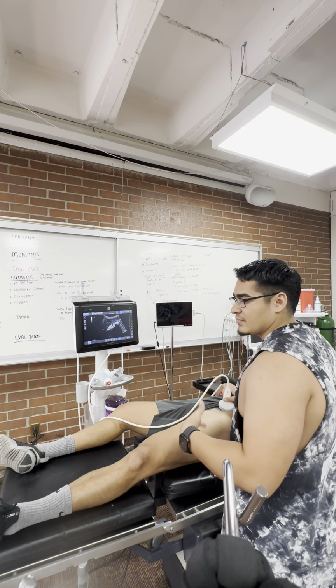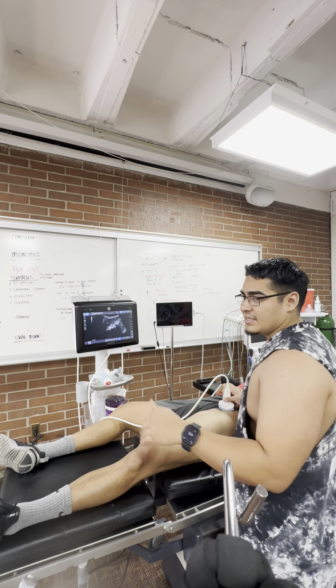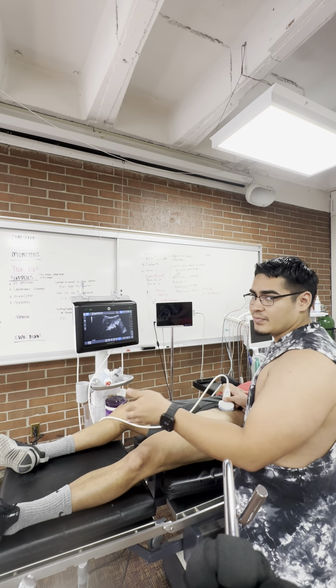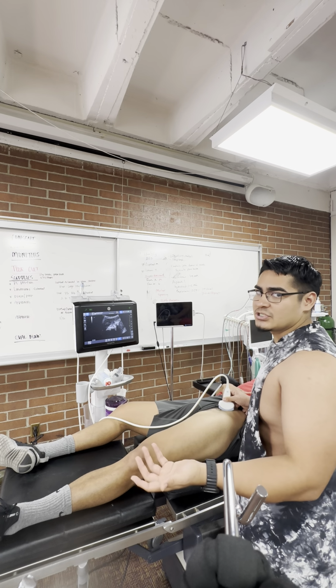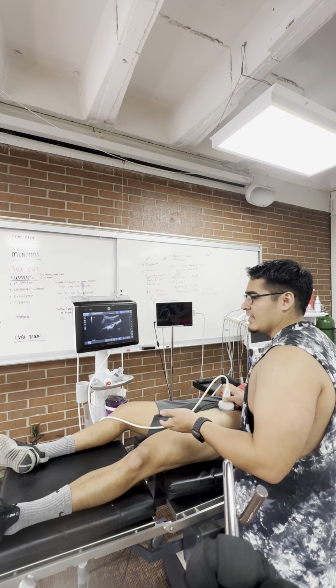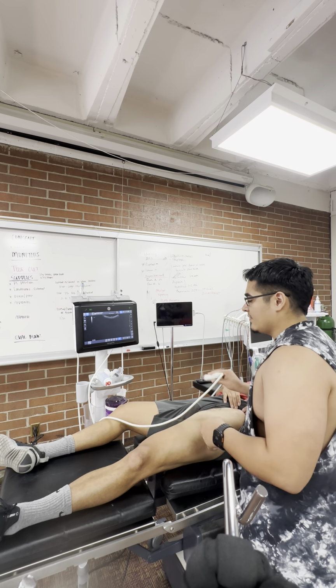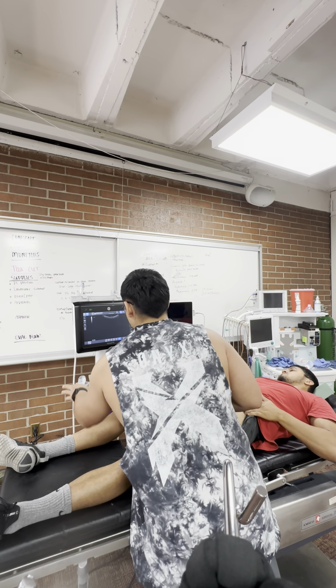And that should be the main way to test, making sure that we do have a proper block, and their pain should significantly decrease from, they would report maybe like a 10 and they would come down to maybe like a 2, so it would help a lot. So they would be ready for post-op pain coverage in that aspect. So after we've done that, we're going to go ahead and show you guys the left IJ.